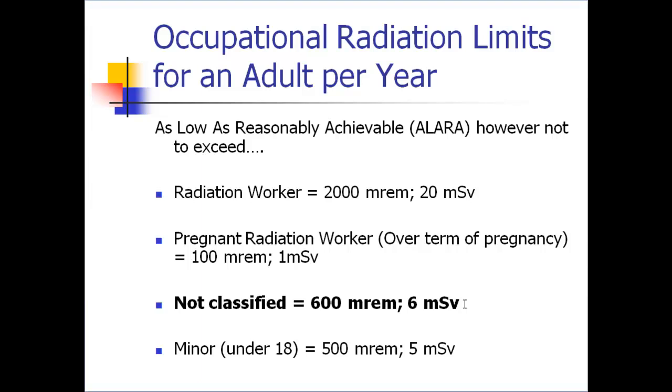Now recall that it's 0.4 microsieverts just to the person who's laying on the bed. So we're still well below anything. Even if we were laying on top of the person who's on the scanner, we would not be getting anywhere close to 6 millisieverts in a year, even if we were the only ones scanning people in the DXA facility.